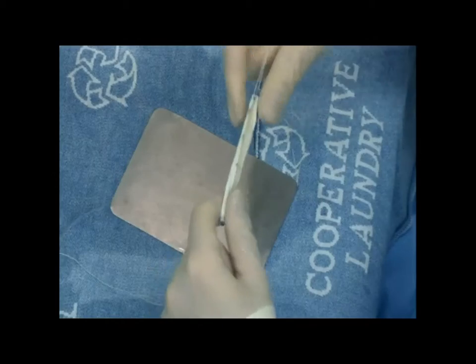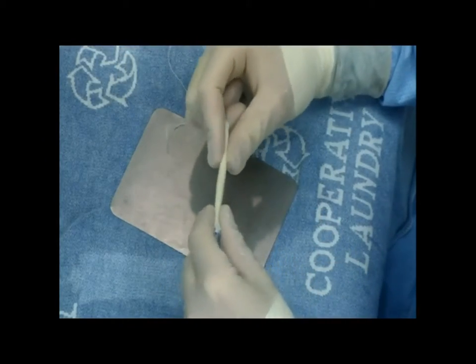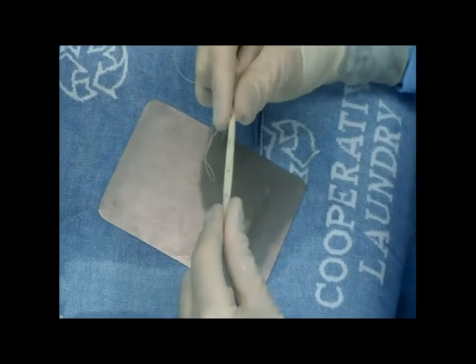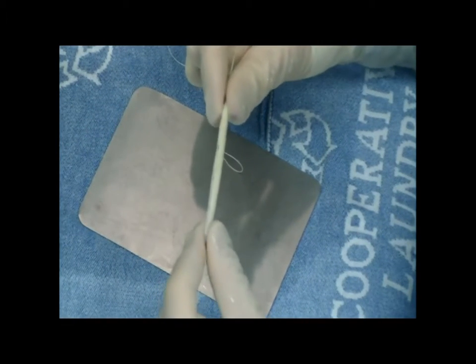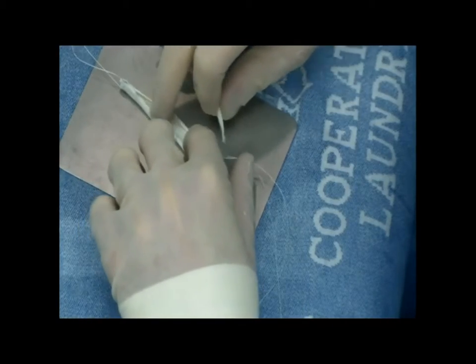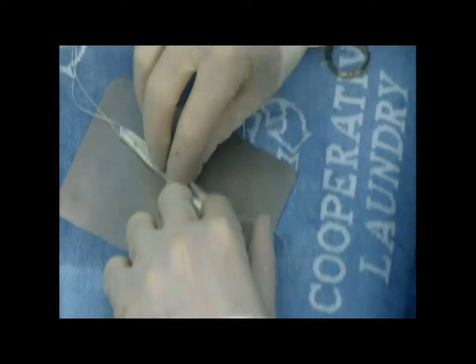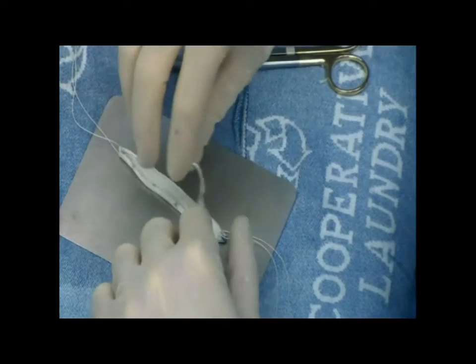Now I test it again — I test it several times through this process to make sure that we're nice and uniform, that the cylindrical shape will be uniform throughout, and that it's the appropriate size. This can be altered during the procedure. You can always subtract some of the graft on the inside or add to the inside as well if you feel that your graft is not the perfect size.